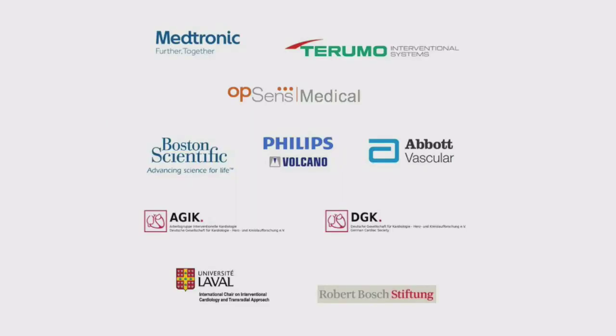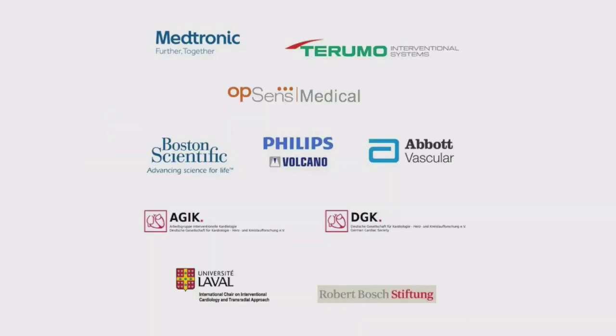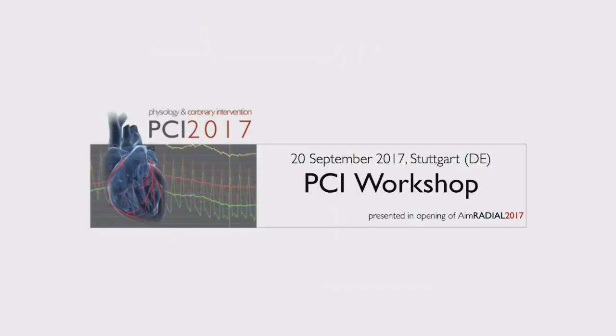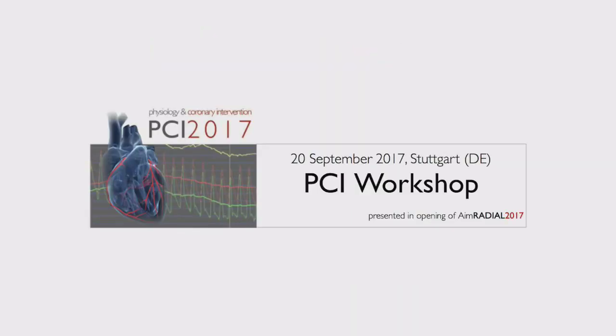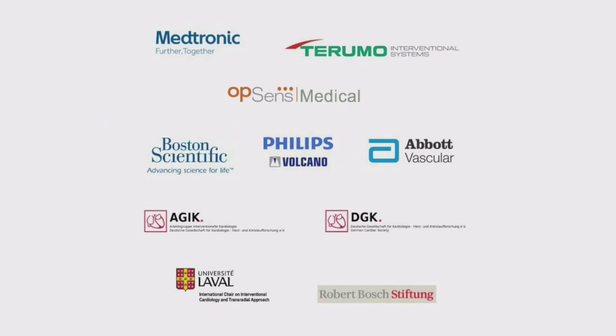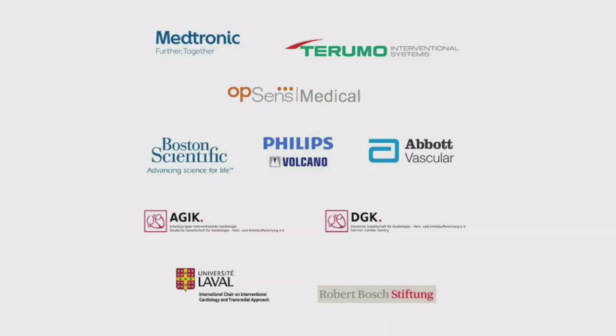What I would like to have as your final comment is that this threshold of 0.90, the more cases we do today, I think is like the holy grail. I mean, we cannot get to 0.90, especially in the LAD. So we don't know, like Dr. Matsuo, who is also doing a lot of post-PCI, and using now the ischemic threshold of 0.80 to stop. Or should we at least optimize and perhaps put one more stent? We simply do not know at this time. That's my view. Exactly, I completely agree, and I think this data set supports what you said.